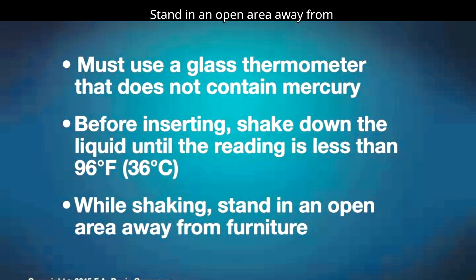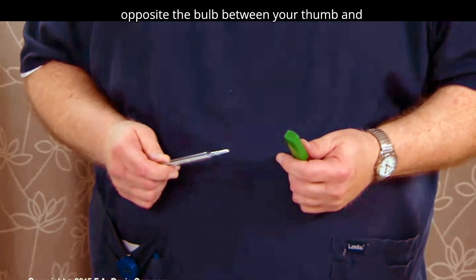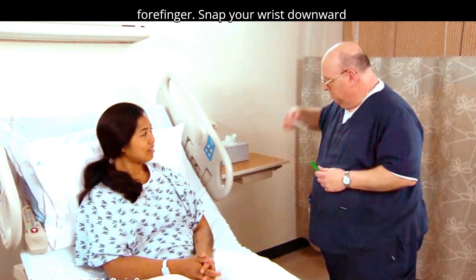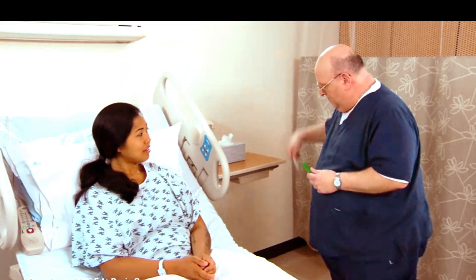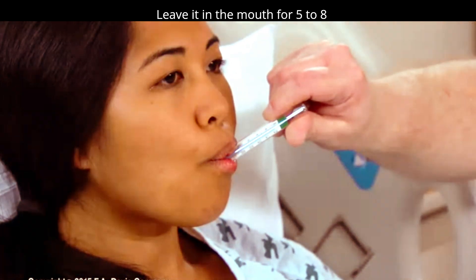Stand in an open area away from furniture. Hold the end opposite the bulb between your thumb and forefinger. Snap your wrist downward several times. Leave it in the mouth for five to eight minutes.